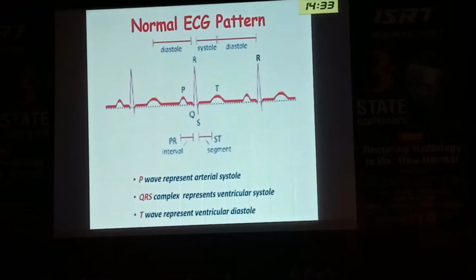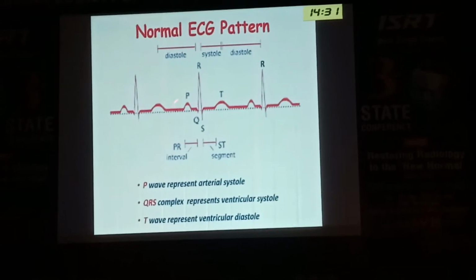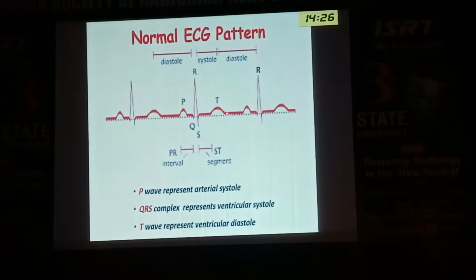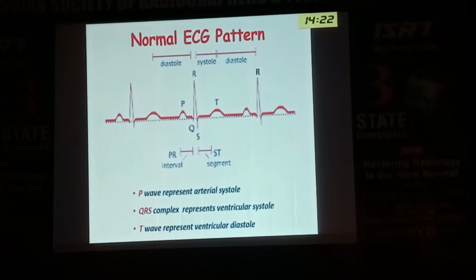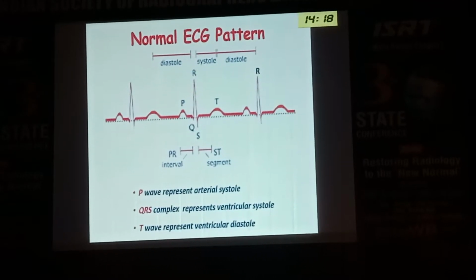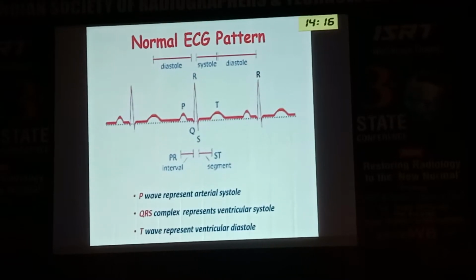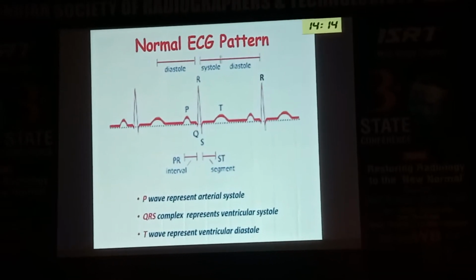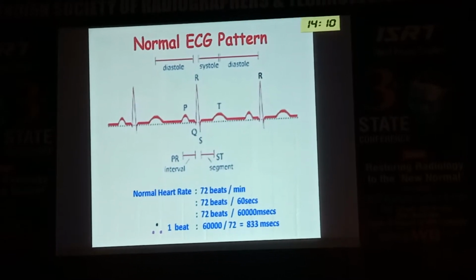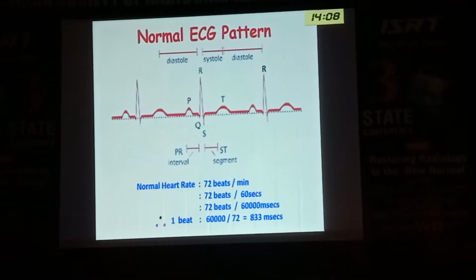Here, what we are actually going to do is, these are all moving, but can you see this flat one? This is called the rest phase. Rest phase means movement will not be there. My idea is to acquire the data during that rest phase. That is called synchronization. How am I going to do that? Have a look here. For that, you should understand what the RR interval is.